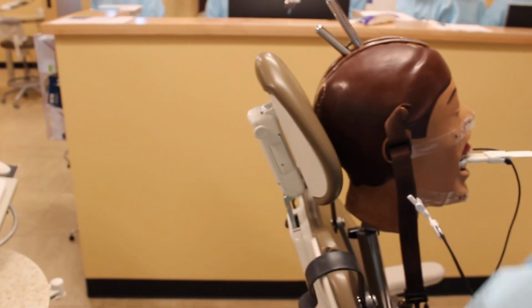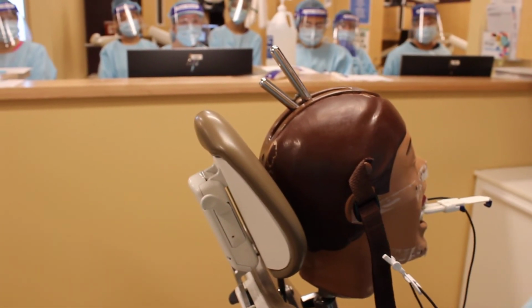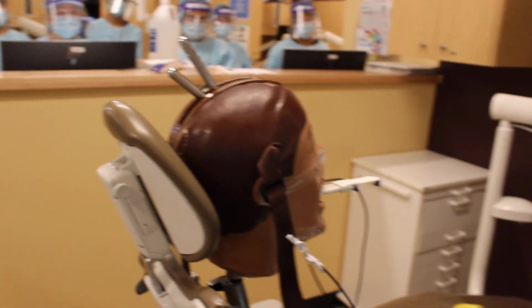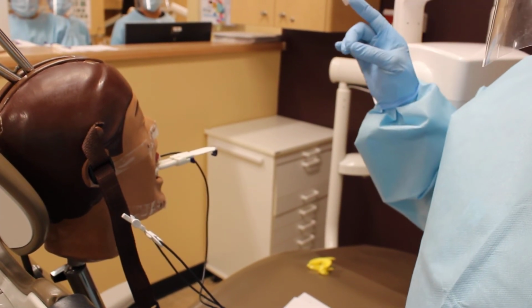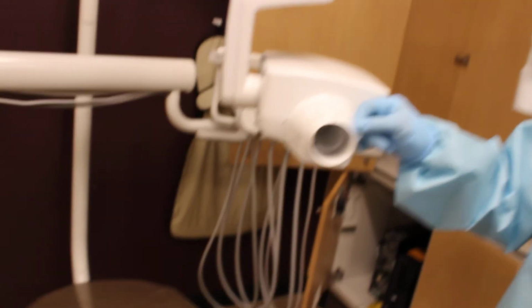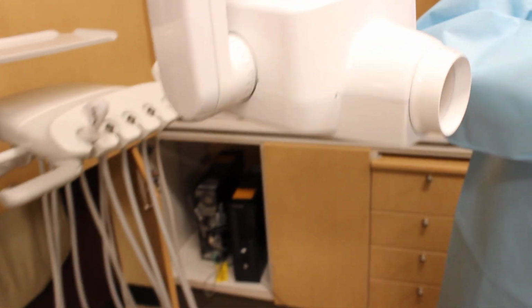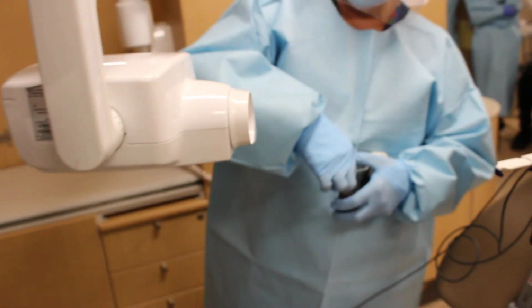Okay. So I'm going to put some tape around this thing, around this PID. If you're in an office that you're there permanently, you can actually put dots, like little stickers, to help you. But since this is not our own place, we're just going to put some tape on here so you can put the dots.